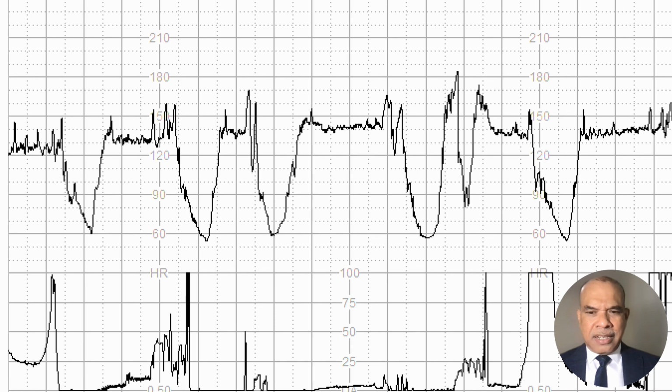In my master classes, I introduced about 18 years ago using a 50 pence coin. And when I used to go to European master classes, I used to use a €2 coin, the largest coin, to cover these decelerations and look in between the decelerations. And this fetus is telling you, yes, I am stressed. I have got transient hypoxemia because I haven't still increased the baseline yet.